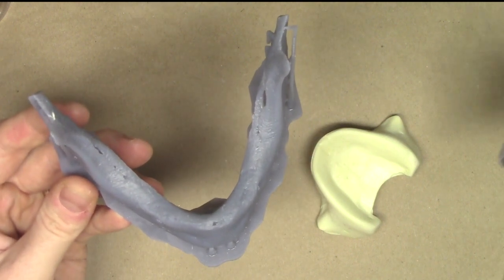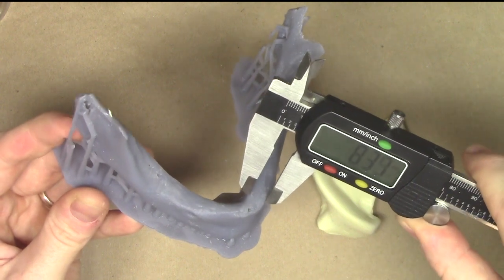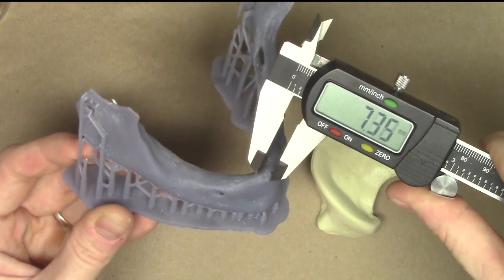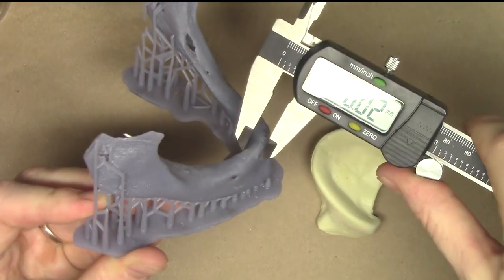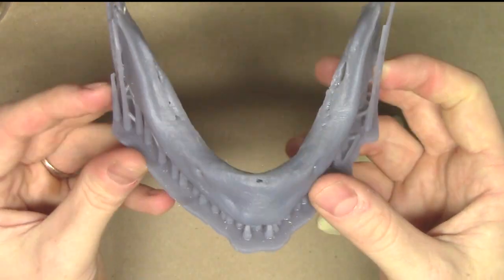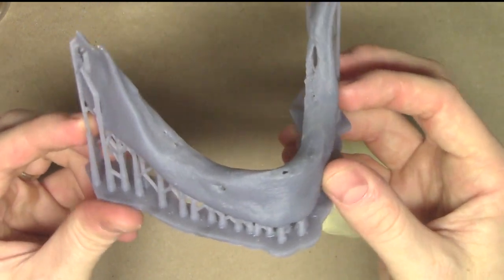If I were to take a measurement of this patient, we could have chosen either standard diameter implants or narrow diameter implants. As you see here, if I just do some measurements on the alveolar ridge, I have more than enough bone width to accommodate either a standard or a narrow diameter implant. So this would be an example of when a patient can be treated successfully with either type of implant, either a standard or narrow.